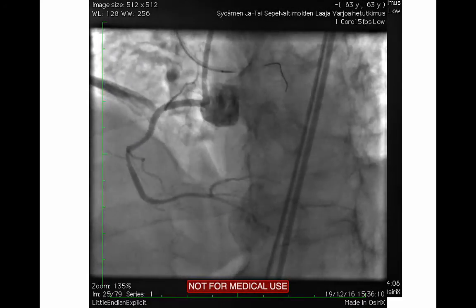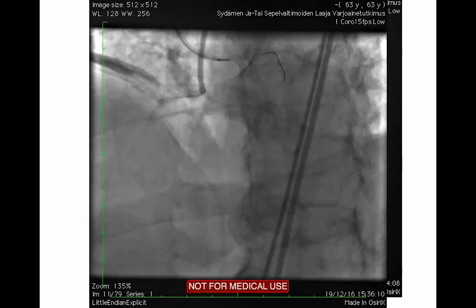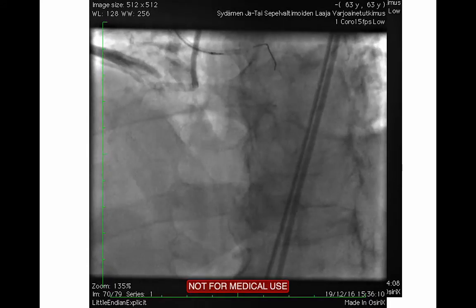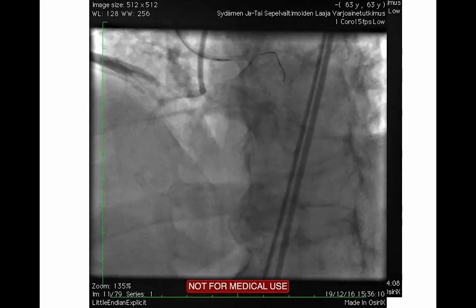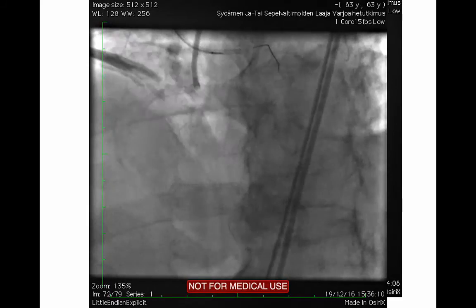Thank you. Perfect. So that was an excellent case. I guess the lessons here are that when you have an ostial RCA, you want to go retrograde because there's no way to work antegrade, and that was a very nice demonstration of that. The second lesson is that to get back into the aorta, you had to use a very stiff wire. And it looks like the Hornet 14 was the one that worked in this particular case. Yes, it did.